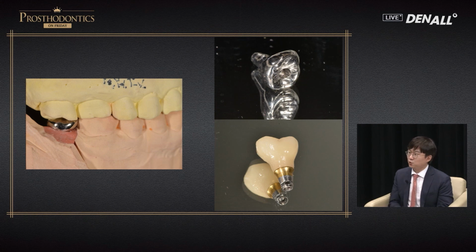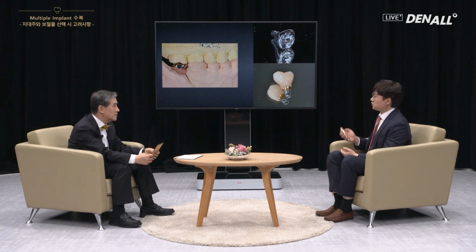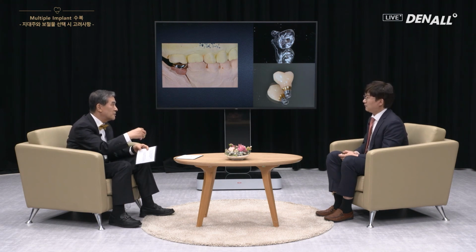That is called the monolithic titanium crown. What is the material? Is that titanium alloy? So the corrosion between the heterogeneous materials would not be a concern. That is right. Thank you very much for the good presentation.